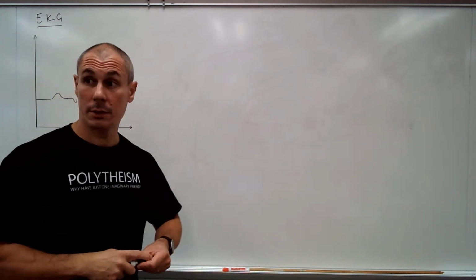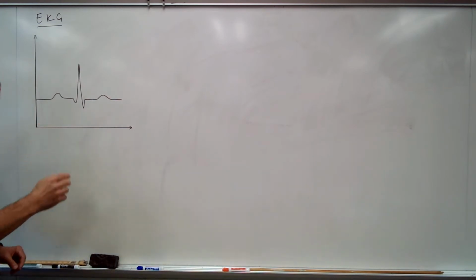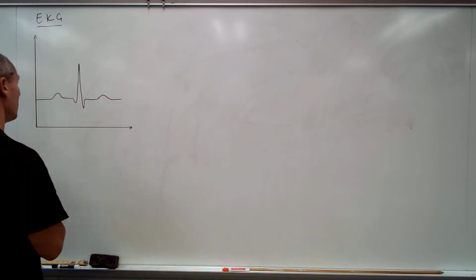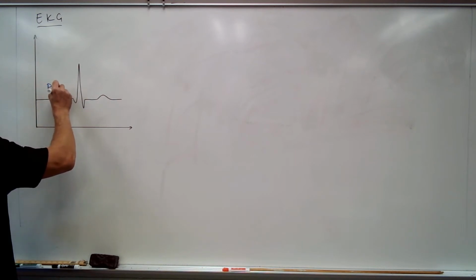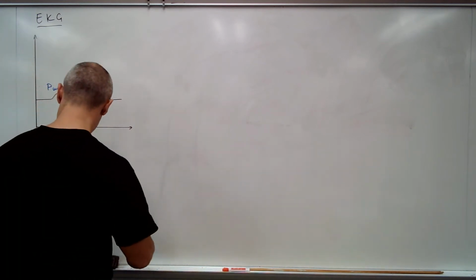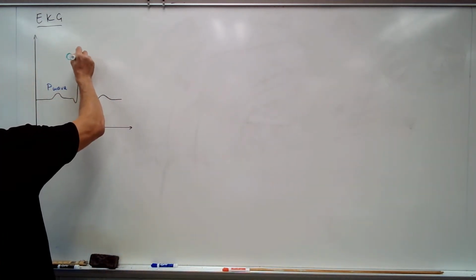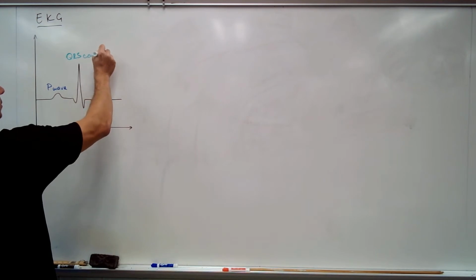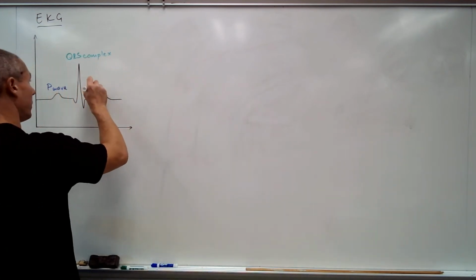So, what are those things? This is the P wave. This is the QRS complex. And this is the T wave.